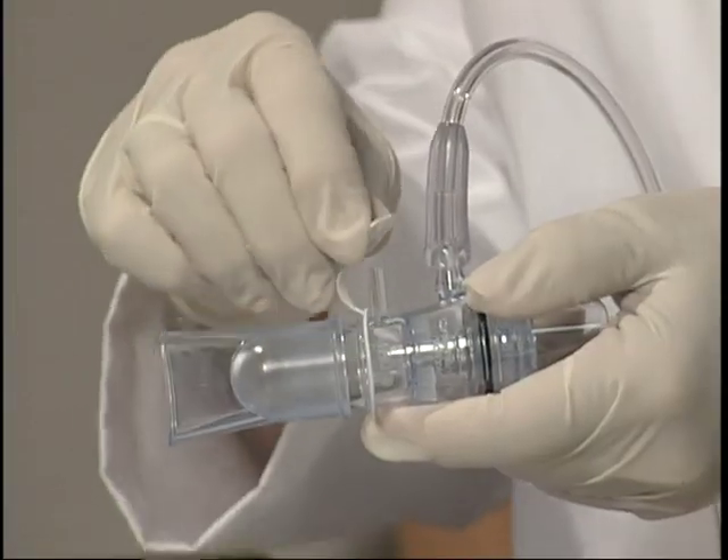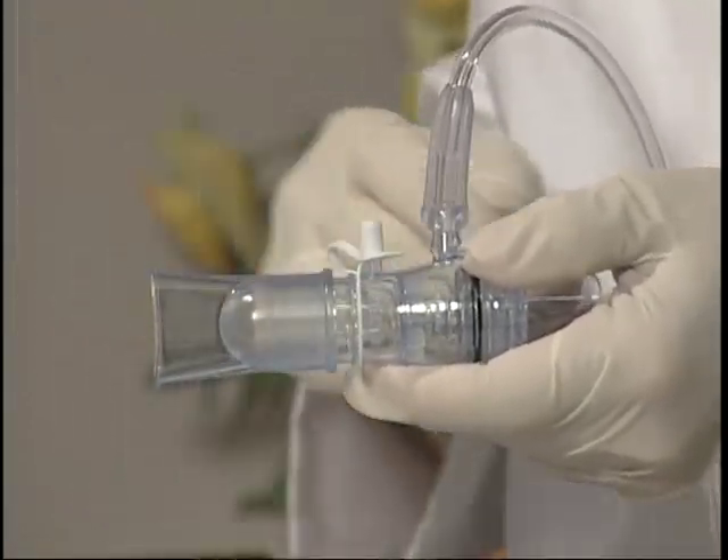Pressure monitoring is recommended for the initial setup to monitor the pressures transmitted to the patient. If pressure monitoring is not being done, seal the port with the attached pressure monitoring port cap. The pressure monitoring port should not be exposed to ambient air while in use.